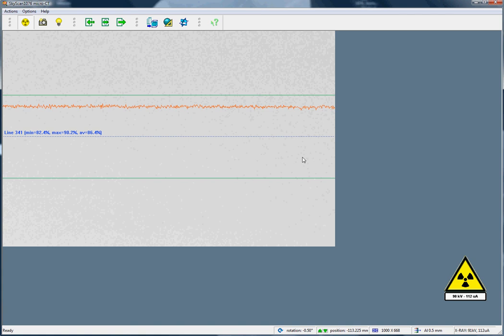Hello. In this video we're going to look at the essential procedure for setting up what we call a scanning mode in the SkyScan 1076 in Vivo Scanner.